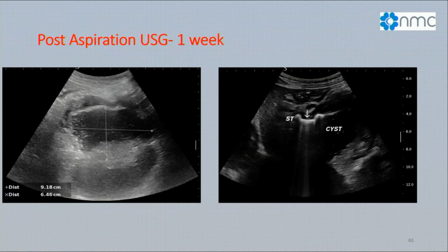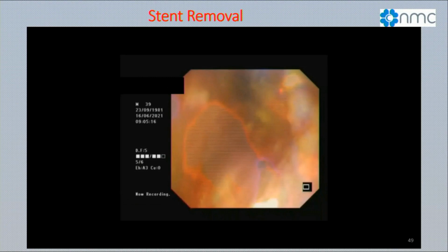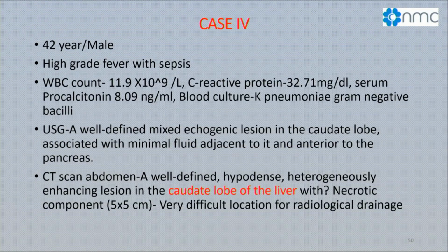And then you'll repeat imaging, and then you'll remove this stent in the next sitting.